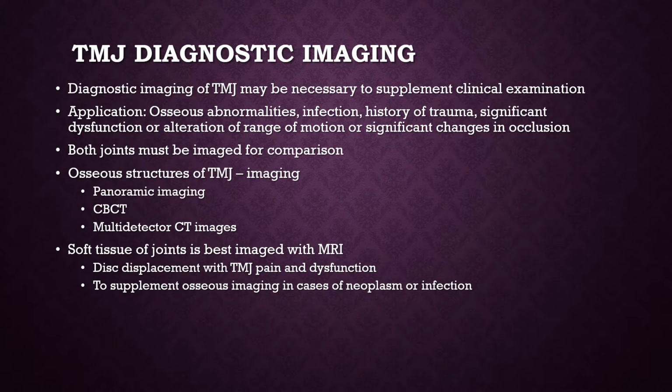The application of diagnostic imaging in TMJ disorders would be primarily to look at osseous abnormalities, infections, cases of history of trauma, significant dysfunction or alteration of range of motion, or significant changes in occlusion. Again, minor TMJ dysfunctions or alterations in range of motion do not really warrant diagnostic imaging. And both joints must be imaged for comparison.